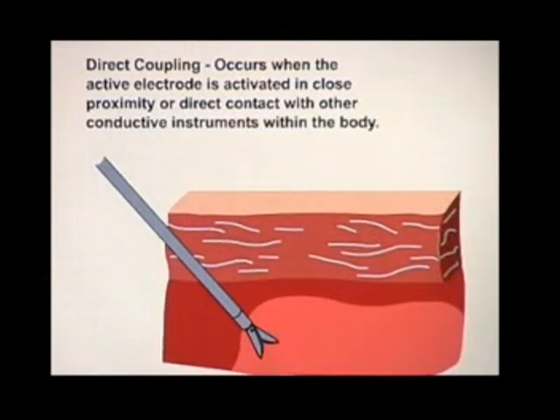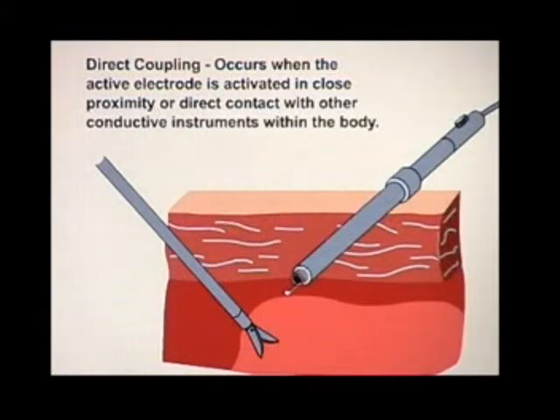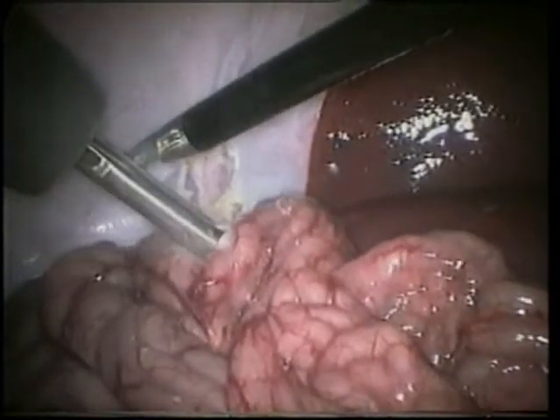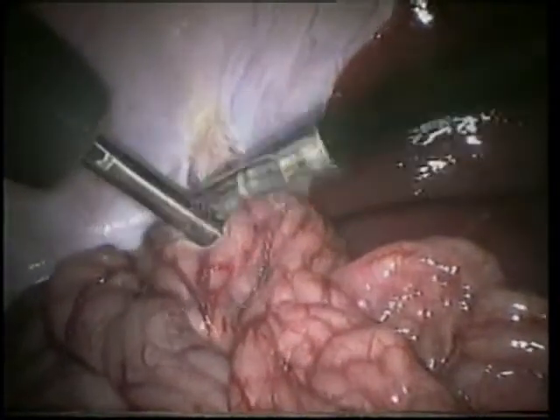This is the accidental activation of the generator while the active electrode is near or touching another metal instrument. In this case, the secondary instrument becomes energized, and the energy seeks a pathway to complete the circuit to the patient return electrode. So, if this energized instrument is in contact with, say, bowel, then this area of bowel will receive the full power of the generator. Not only that, this will very likely be outside the area of vision and will go unnoticed. There is potential for significant patient injury in such cases.